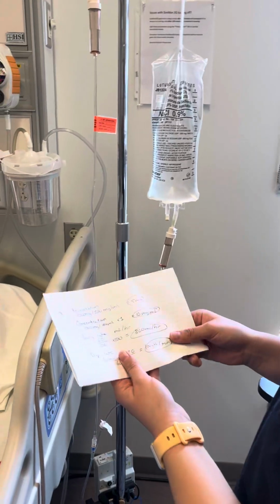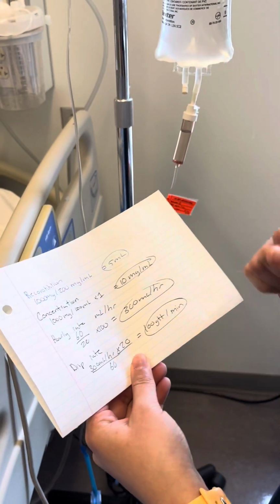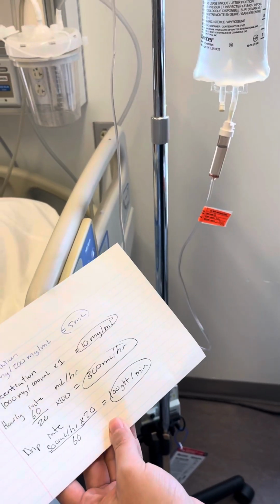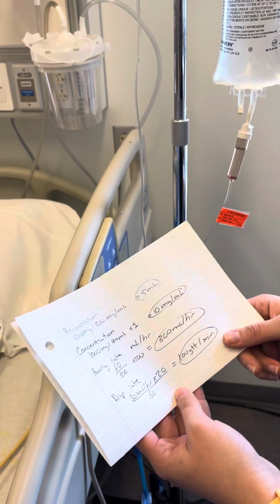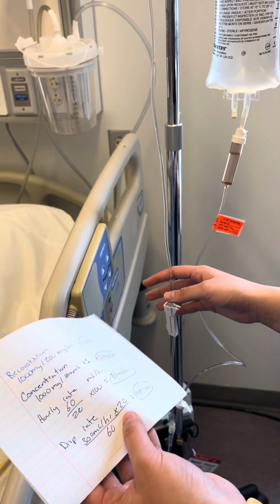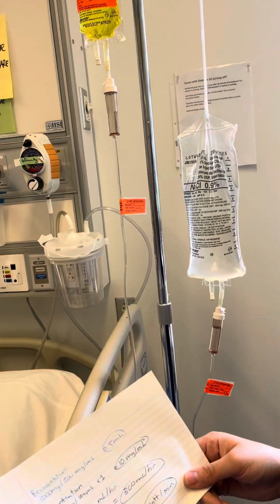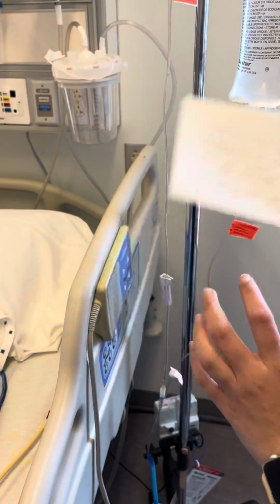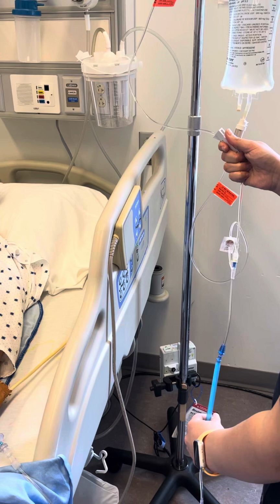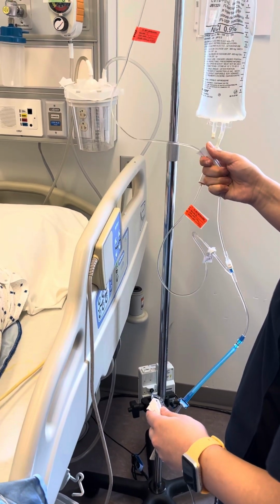Okay, so here's where our medication calculations come in. I've done that. We've figured that out. Hourly rate, it would be 300 milliliters per hour. So if there was an Alaris pump, that's what I would put into the machine. But because we're just doing the IV line on its own, the drip rate would be 100 drops per minute. I'm not going to do that for the sake of the length of this video. But that's what it would be. So I would open this pump to 100 drops per minute.